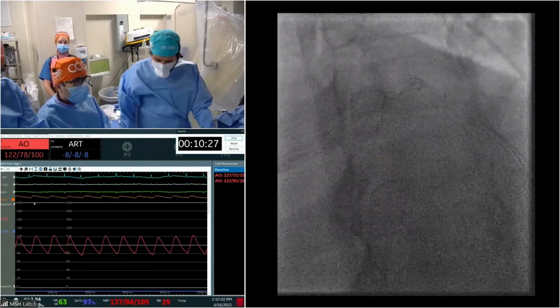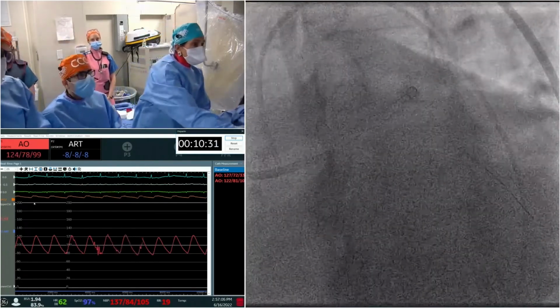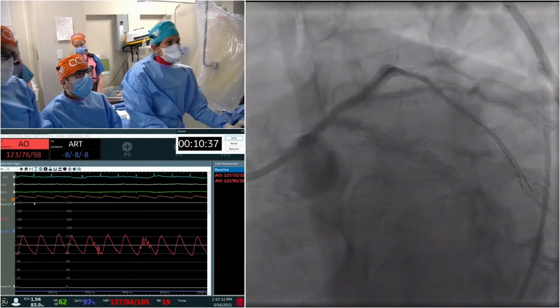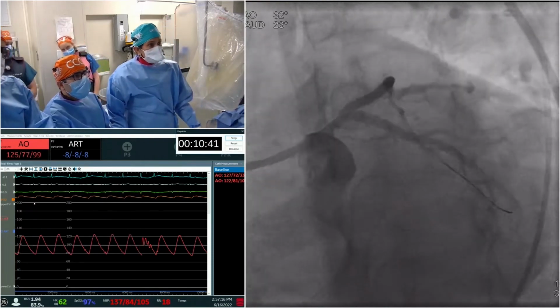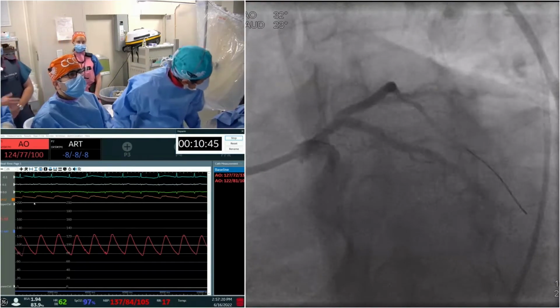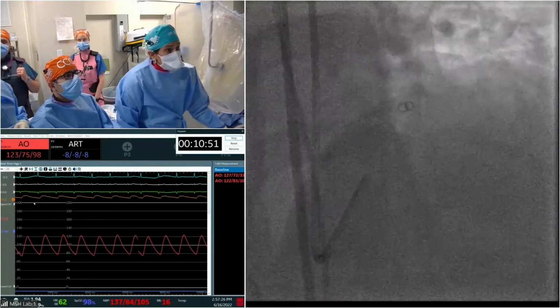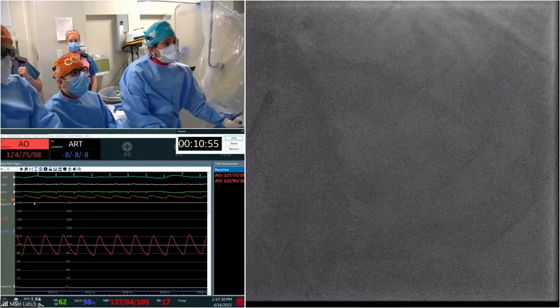Greg thinks there's a lesion there. He said it from the beginning. Yeah, in the AP cranial, it looked worse. There's an intermediate lesion there. That doesn't show it at all because it's overlapped, so it's good. No lesion seen. In the AP cranial, it looked worse. Your setup shot, I did not think there was a lesion, but okay. Well, you see it better than we do. The conference monitor is a little far away from us.